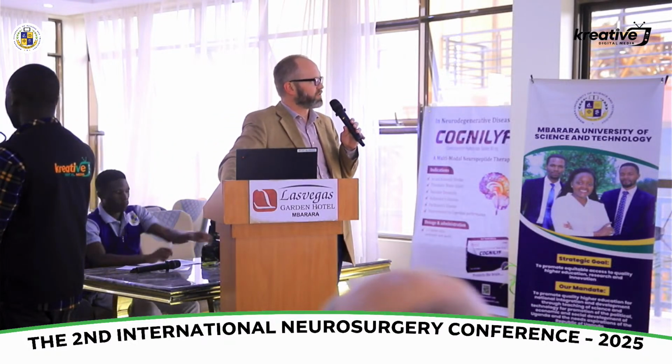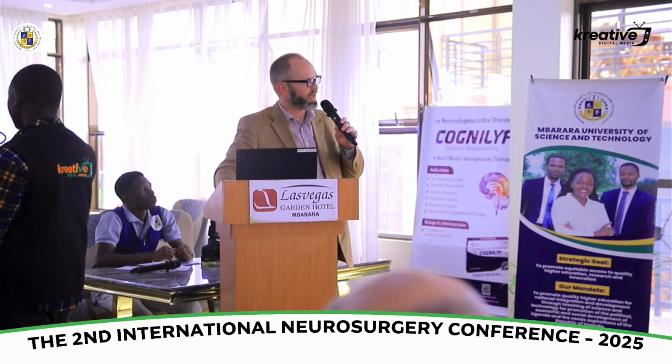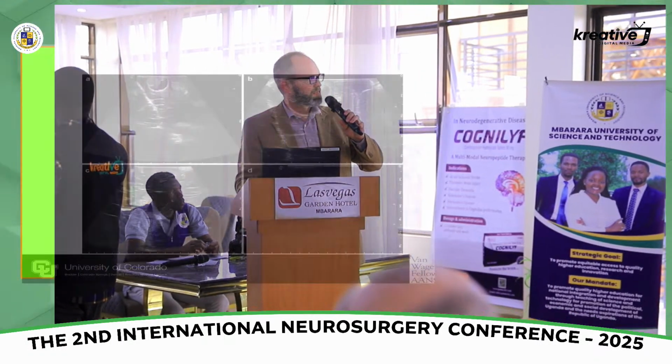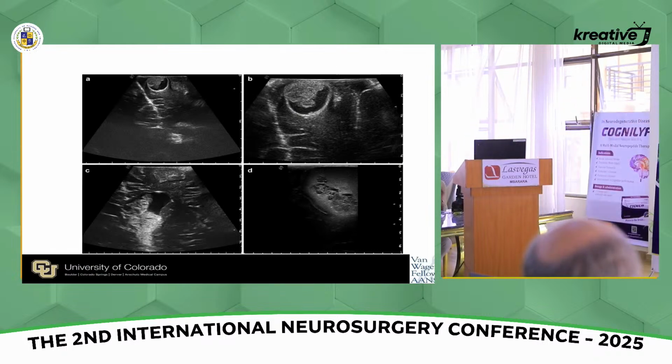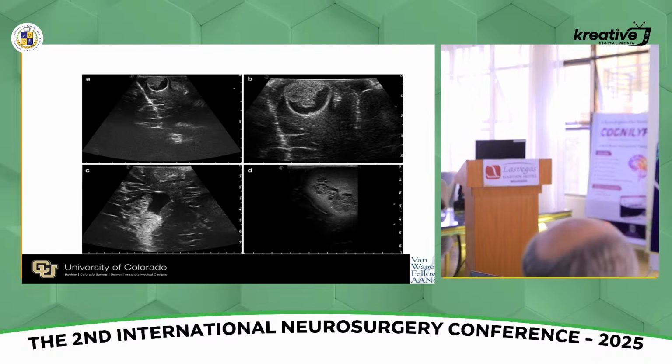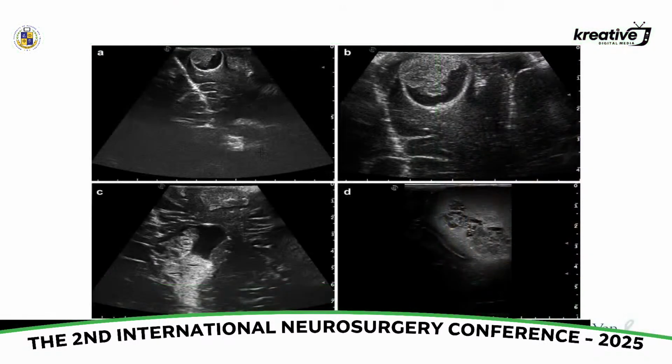This is a coronal view of a brain tumor, relatively superficial. You can see that it has a cystic component as well as a nodular component, and then there's edema surrounding it. So you can see this is the normal white matter, and this is the edema, a little brighter, and then the wall is quite echogenic, which is common because wherever you have a sudden change in tissue density is where you're going to get a lot of reflection, which then becomes a bright signal, okay?